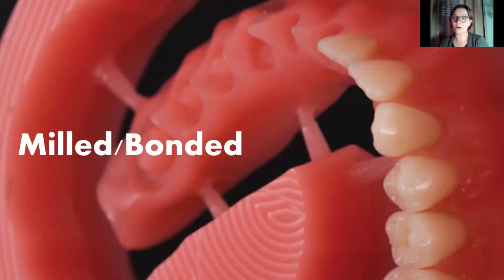You're capitalizing on the better fit and adaptation from the mill, but you can still use carded denture teeth if you prefer the aesthetics and mechanical behaviors of those. A lot of clinicians that have been doing dentures for a very long time or do a lot of dentures in their practice are very partial towards specific brands of denture tooth. I like the P6 mold from Dentsply Portrait. I'm just teasing. I like all the molds. But a lot of clinicians become very partial to a certain brand or a certain mold or a certain aesthetic, and you can still use those same denture teeth in your denture base.